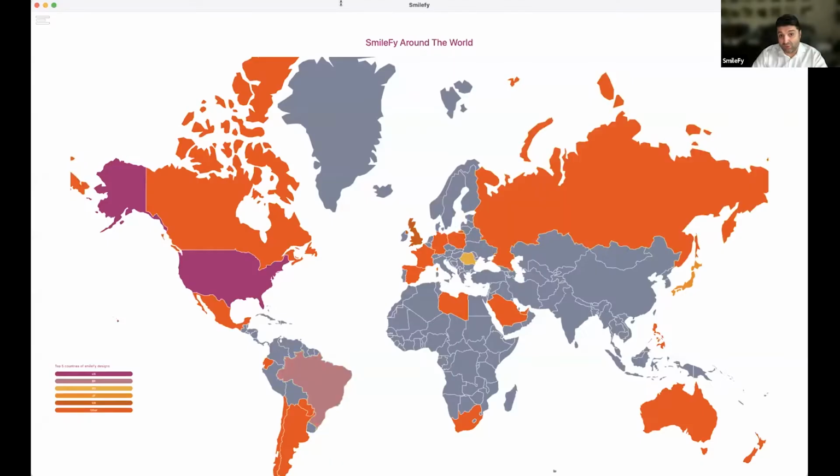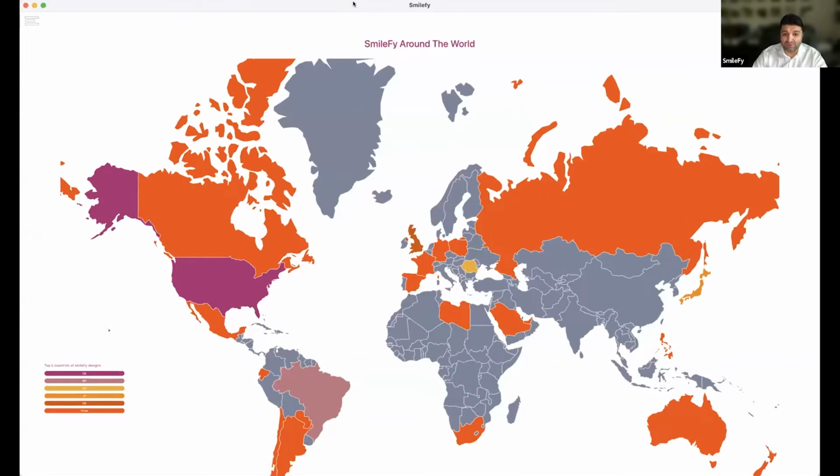As you know, the first page of Smilefy shows you the real-time smile designs in the world. That's a beautiful thing, because we see everywhere where the countries have a color, people right now design smiles.